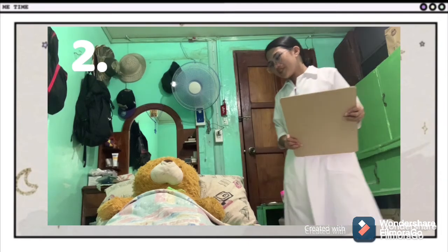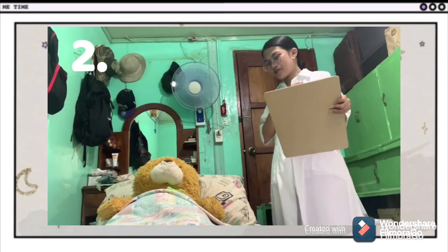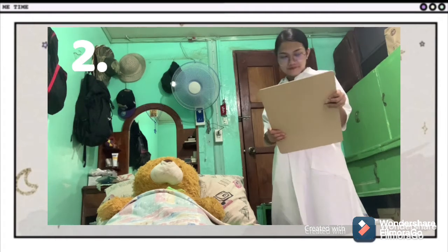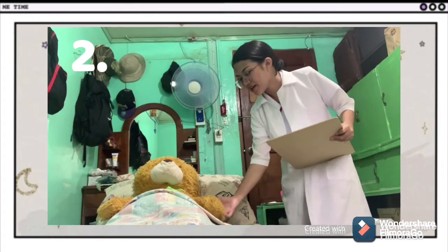Hi ma'am, good morning. I'm a student for today. May I know your name, ma'am? Ensures the right client and elicits cooperation.